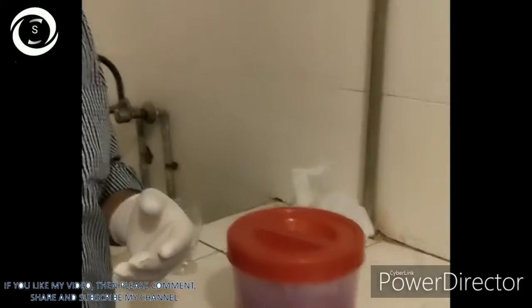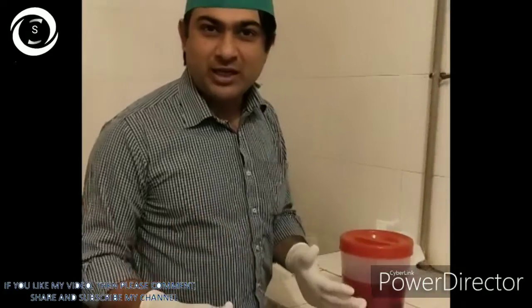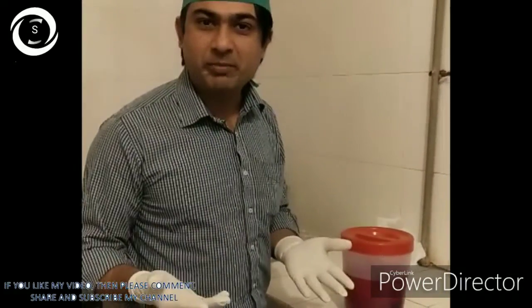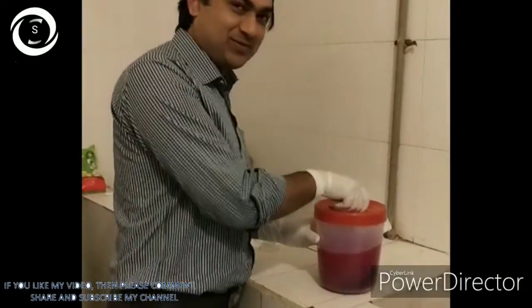Hi, I am Dr. Sharjeeel and today I would like to show you how to prepare amniotic membrane from placenta for different uses in ophthalmology.